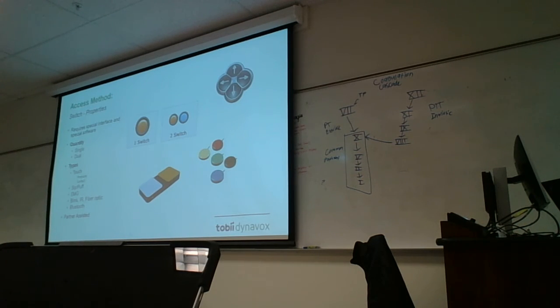Different switches. You could spend a whole class probably talking about different types of switches that are out there. Generally the switches are either ones you plug into a switch port and then you're able to activate it and it sends the command to the device. There are Bluetooth switches as well. And then there are blink switches and puff switches, where someone has a switch in their mouth and they activate it by blowing air into it. There are single switches and double switches, so it really does depend on what the user is able to access.